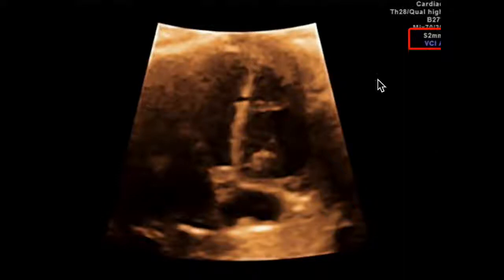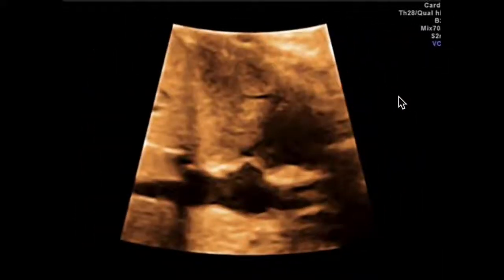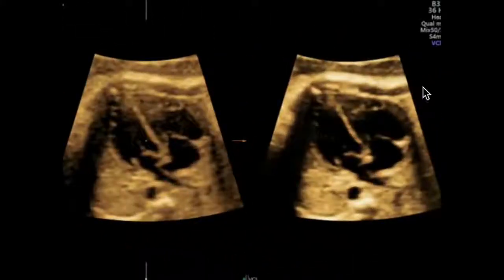Given that this fetus was chest up and the apex was almost directly at 12 o'clock, I rapidly turned the transducer 90 degrees to see the VSD, which us non-cardiologists always sort of believe are holes, but they're not always holes. Sometimes they're slices. So here's the VSD in VCI-A imaging from a different direction.